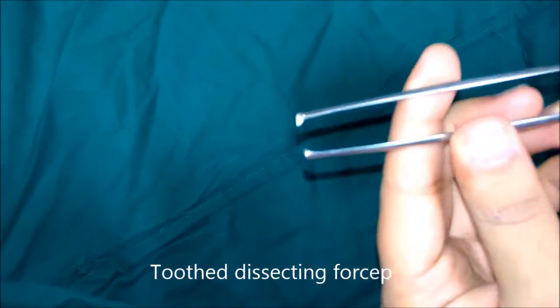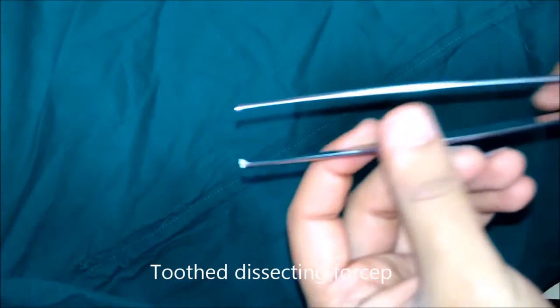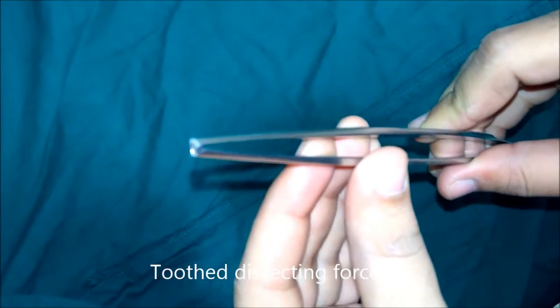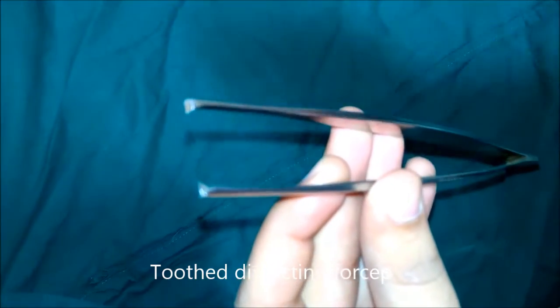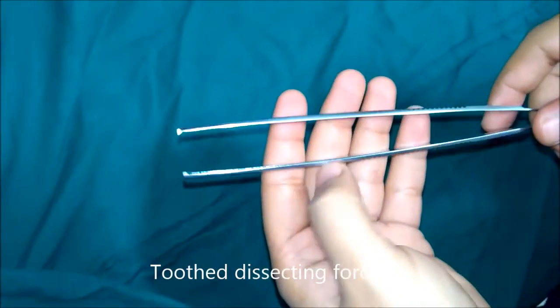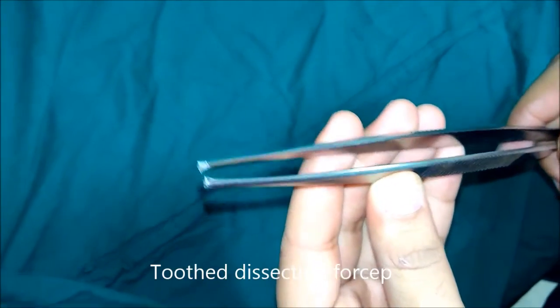This is tooth dissecting forceps. It has a tooth at the tip of one blade and a groove at the tip of the other blade. The teeth are designed so that the tissue may be better gripped and there is less chance of slipping. This is used to hold tough structures like skin, fascia, and aponeurosis.